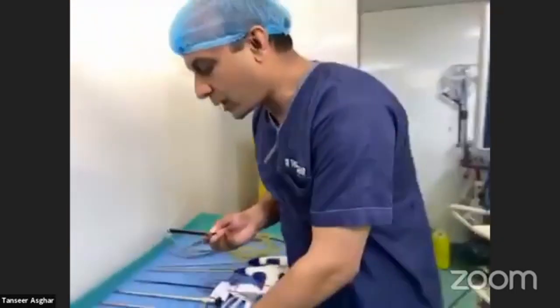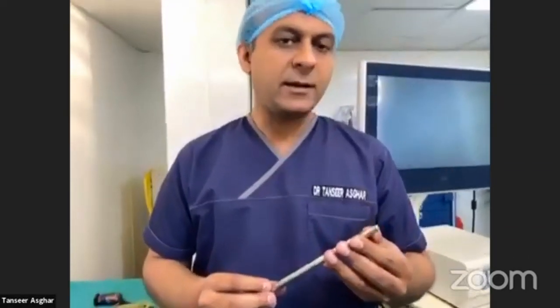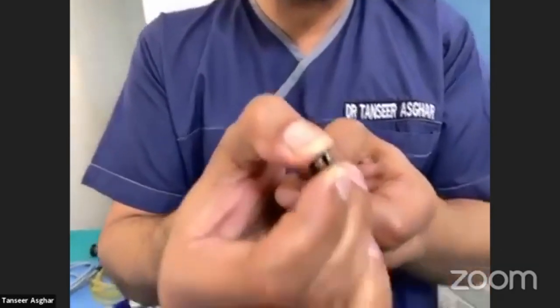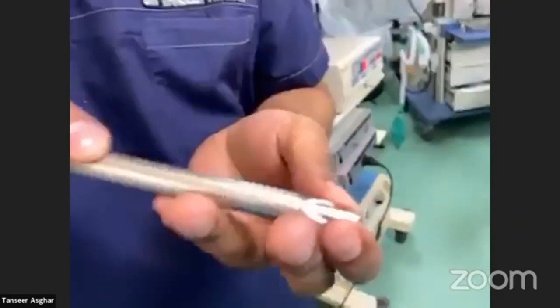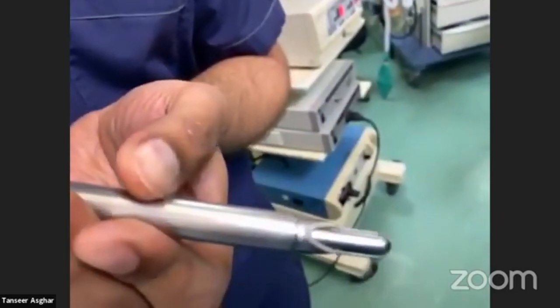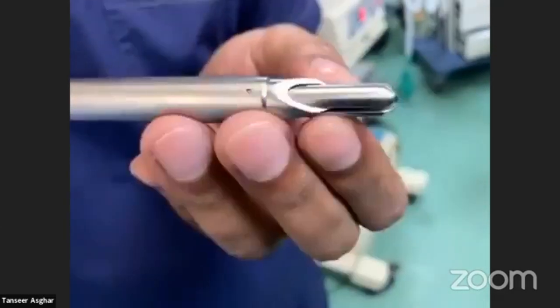Coming on to the trocar first. Trocars are of different types, both in disposable and reusable forms. This is called the safety trocar. You can see there is a safety wall over it and a sharp edge inside. When you enter the abdomen through the sharp end using clockwise and anticlockwise motion, the safety guard comes out, protecting the viscera from damage. That is why it is called the safety trocar.